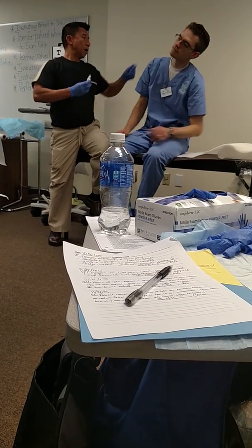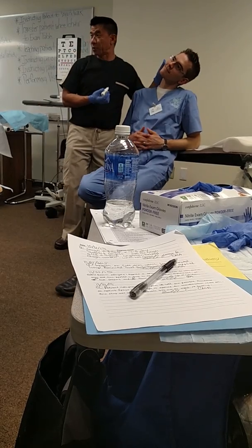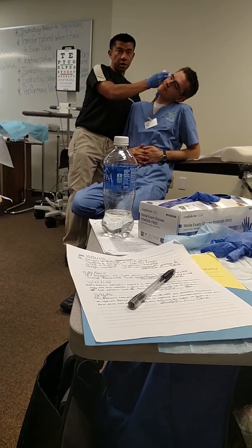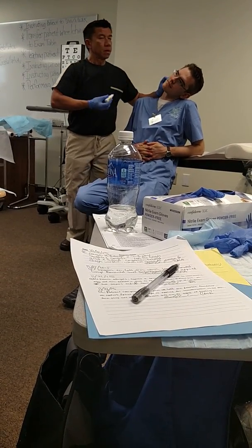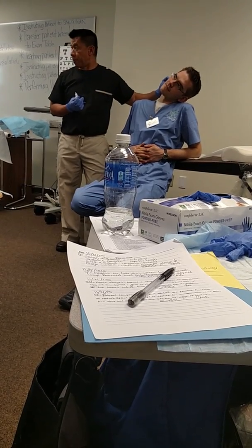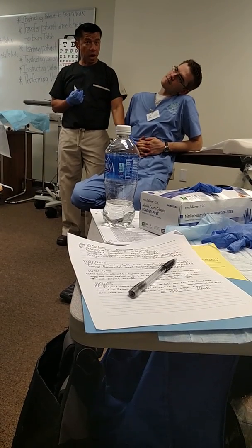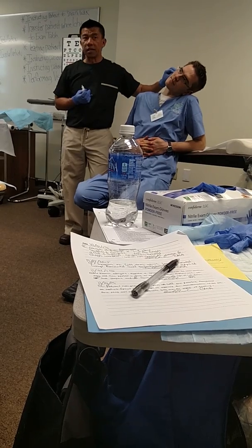All right, Eric. I'm going to drop a couple. This is the best way to practice in the clinic. Making sure it's 2 drops based on the doctor's order. Have the patient stay there for a few minutes. And if there's any excess medication or fluid coming out of the ear, you can just give them the what? Normal gauze, or just put this moist cotton ball to make sure that it doesn't drain back.